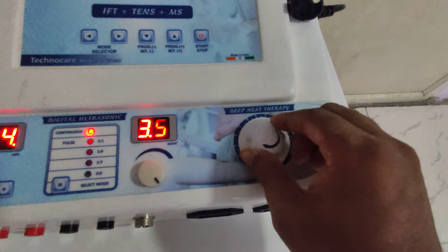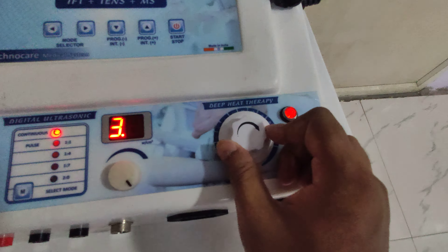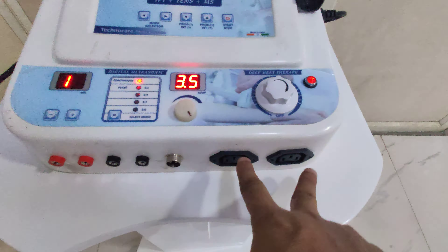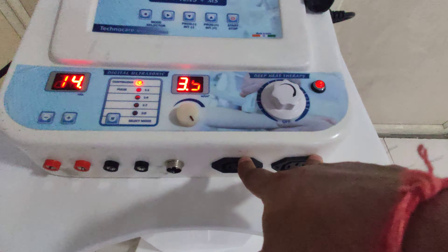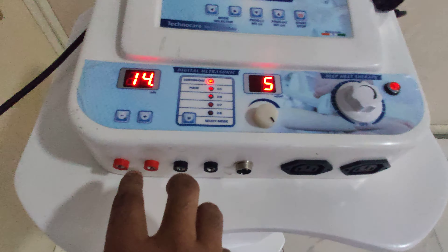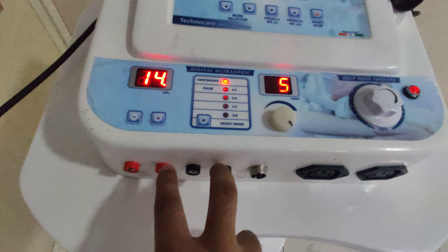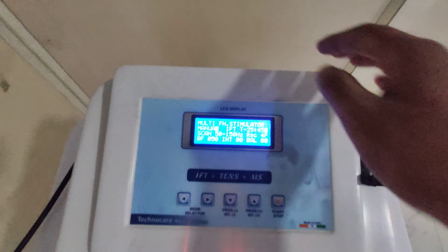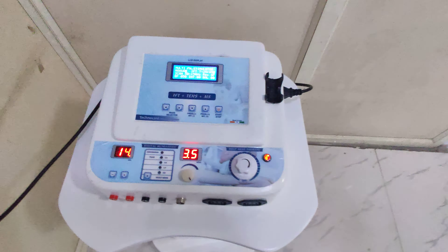For operating the LASER input, it's so simple and easy — simply turn on this rotary button. You can plug the deep heat pads over here. This one is for IFT leads and pads, and this one is for ultrasonic. So this is the way of operating this machine.